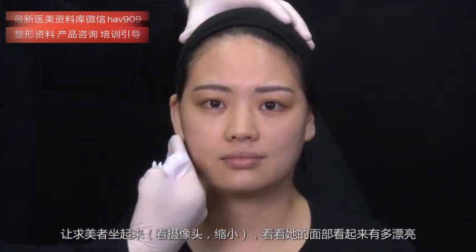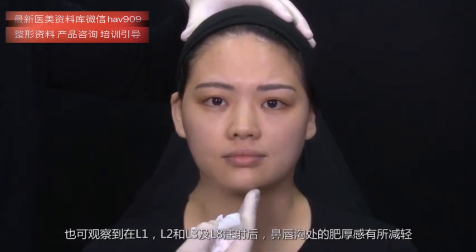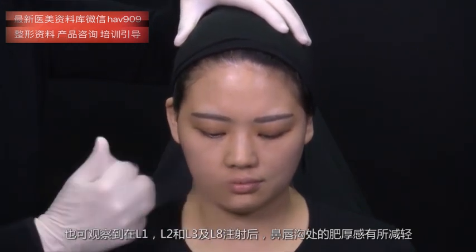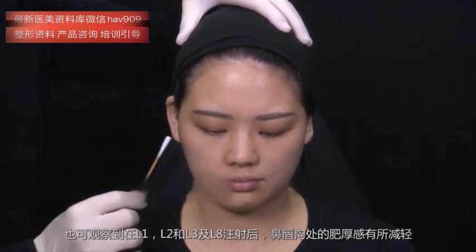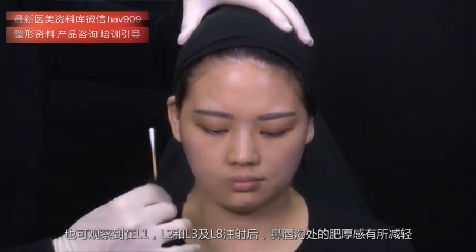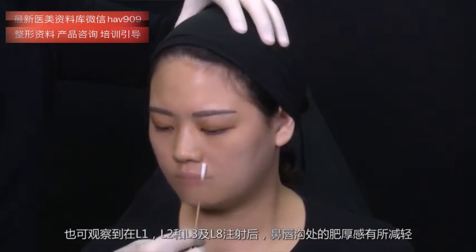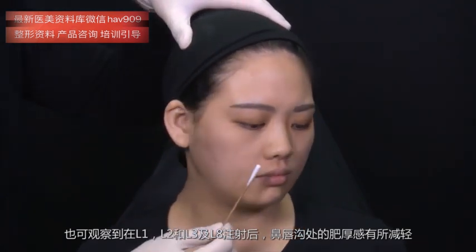Look at the camera. Zoom out. Take a look how beautiful her face looks, and please observe that now, after L1, L2, L3, and L8, the heaviness over the nasolabial fold has decreased.